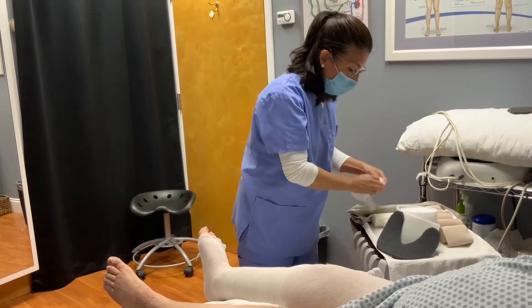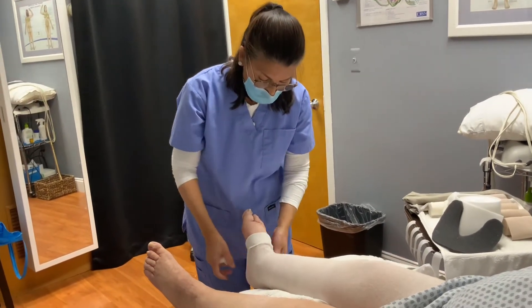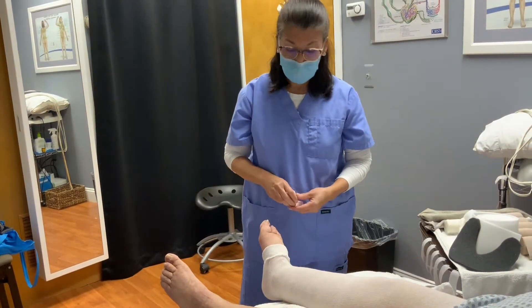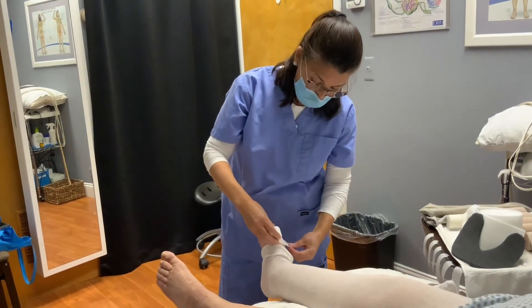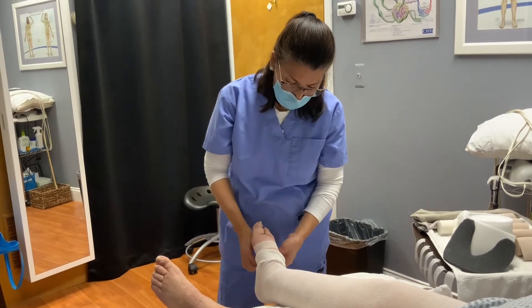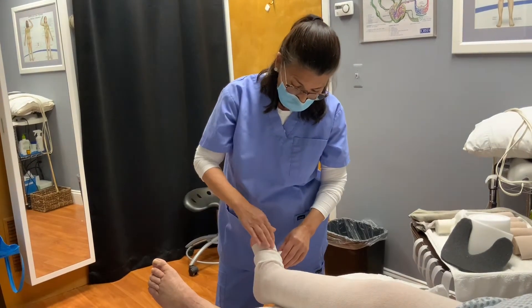The next thing that is going to get done is application of a toe wrap. We want to make sure that the toes are wrapped to prevent any backflow once you put the bandages on. This is a one-inch toe wrap — you don't want to go too tight, you're not digging in. It's really just laying on and actually covering the dorsum of the foot.